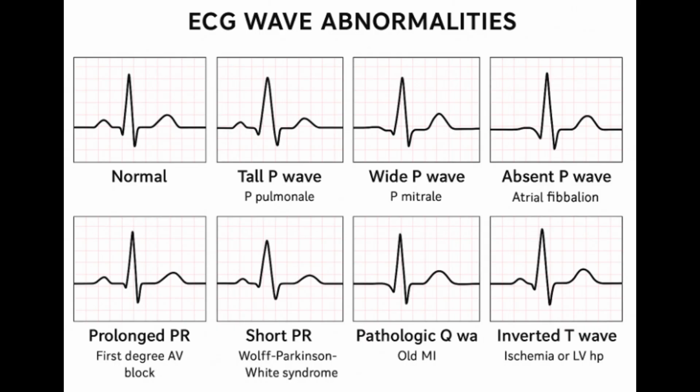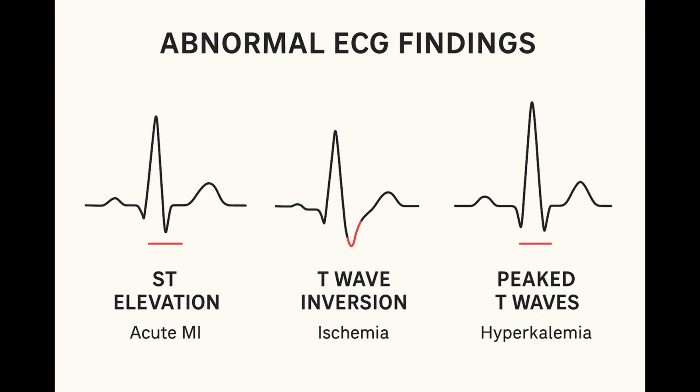Okay, electrolytes covered. Let's move to arguably the most critical part for emergency diagnosis, the ST segment. That flat line normally between the QRS and the T wave. Deviations here mean trouble, right? Like heart attack territory. Exactly. The ST segment should normally be flat, isoelectric, right on the baseline. If it goes up or down significantly, that indicates myocardial injury or ischemia. This is where we diagnose MIs.